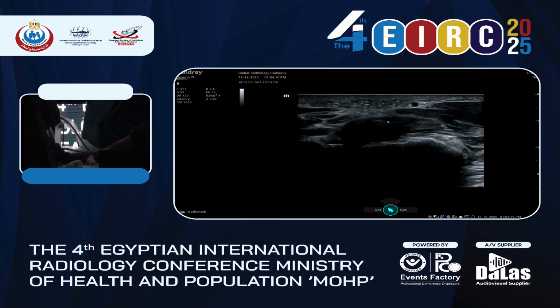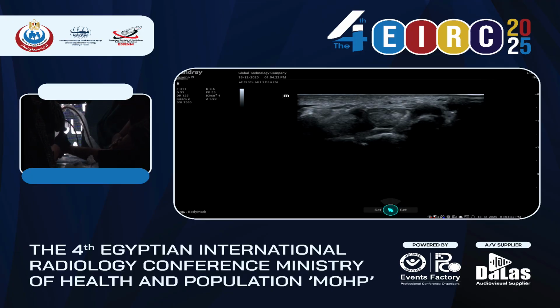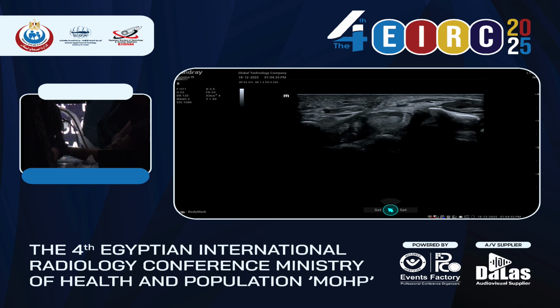At this level, a nice trick is to take the patient's hand, like that, and ask the patient to release the pressure on the hand, because we want to control the position of the hand ourselves. So as we scan towards the palm, we need to get rid of anisotropy and make our nerve as evident as possible.